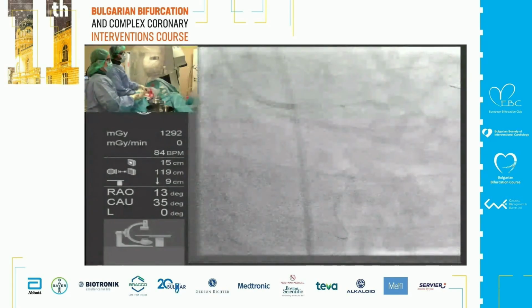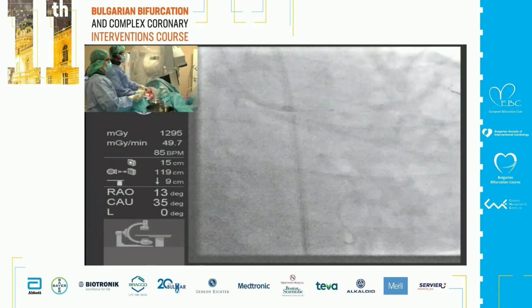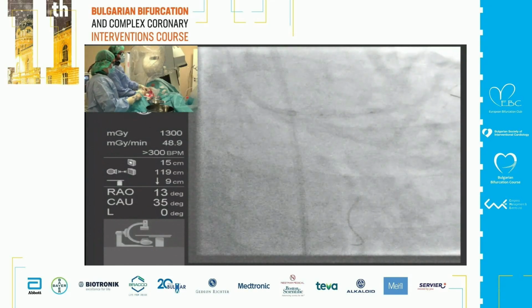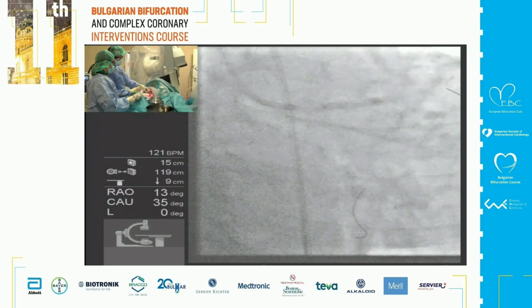You can inflate another time and go to higher pressure because it's too small. Remain inside the stent, of course. Don't go to the bifurcation. What do you mean? What's the purpose of the...? Leave your balloon there. Come with the 4.0.